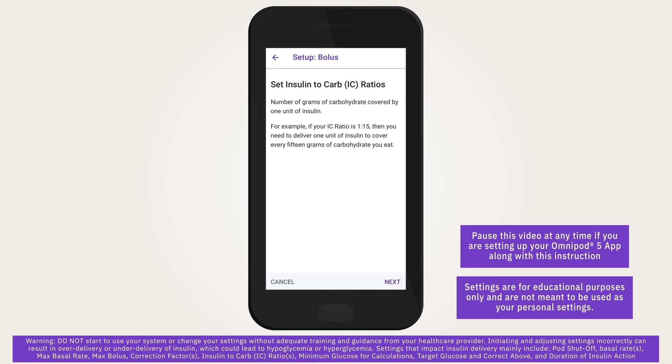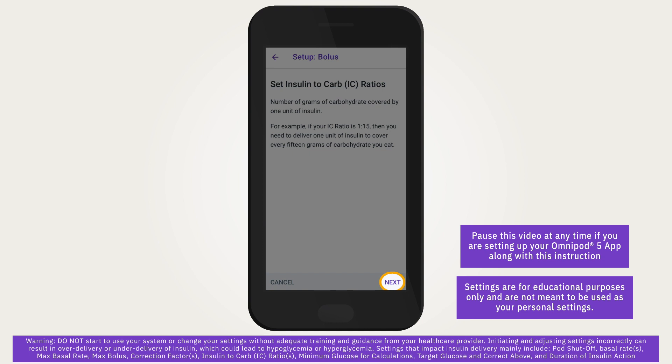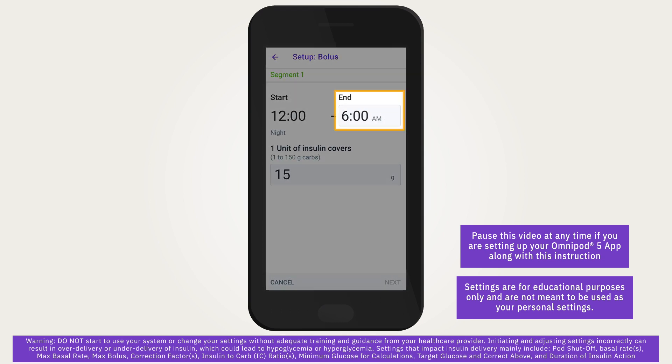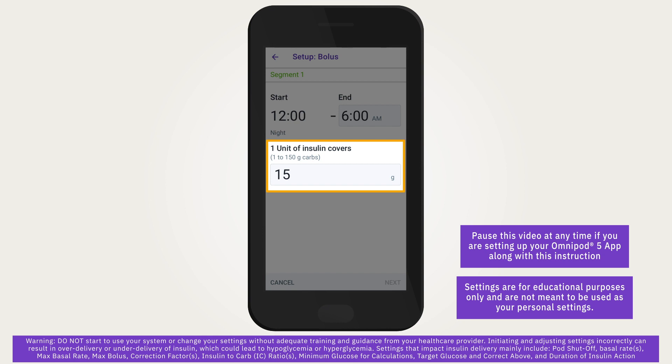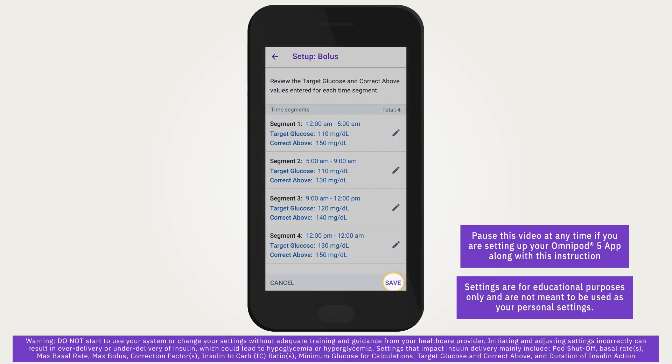Insulin-to-carbohydrate ratio, or IC ratio, defines how many grams of carbohydrates are covered by one unit of insulin. The bolus calculator uses the IC ratio to calculate a suggested meal bolus. You can create up to eight different IC ratio segments per day. Tap next to start setting up segments. Tap the end time field and specify an end time. Tap the one unit of insulin covers field and specify the IC ratio value for that segment, then tap done to close the number keypad. Review and tap next. Repeat until all 24 hours are complete. Once everything is confirmed correct, tap save.